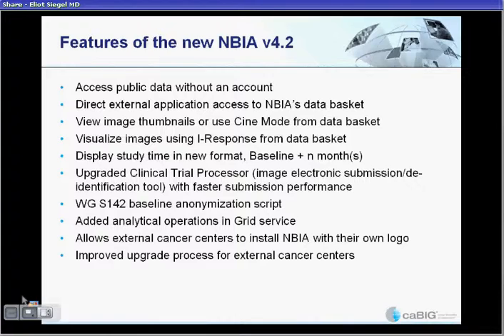With regard to features of the new version of the software, which, as I mentioned, you can download, it's free and open source, so that you can set up the software on your own server. New features include access to public data without needing to sign into an account or set up an account, although the advantage of setting up an account is that it will remember you when you come back and allow you to be able to finish a download or to get additional images associated with a saved query.